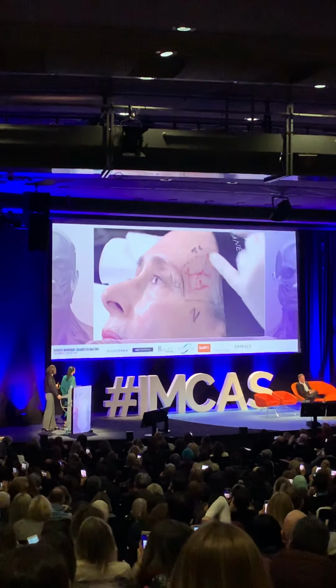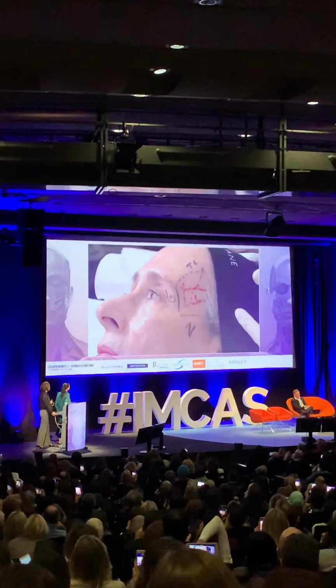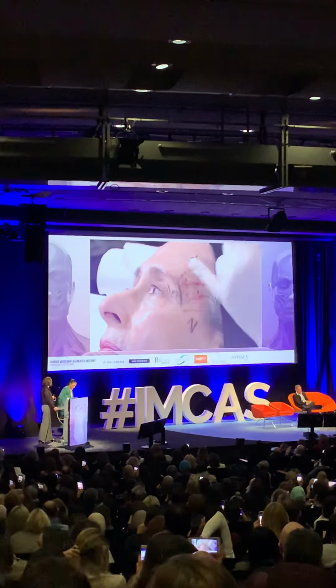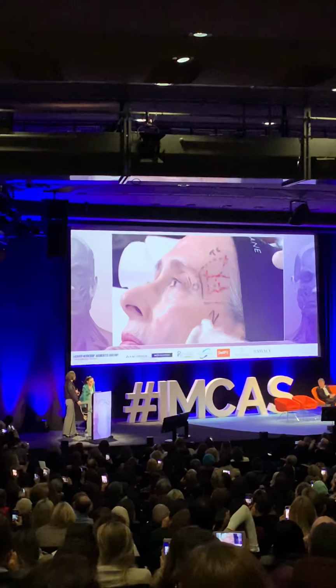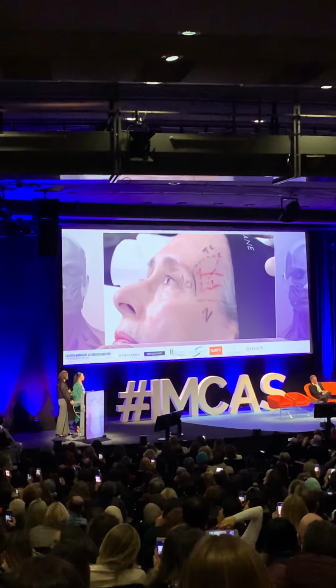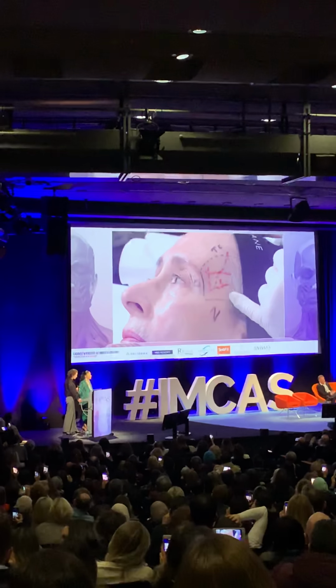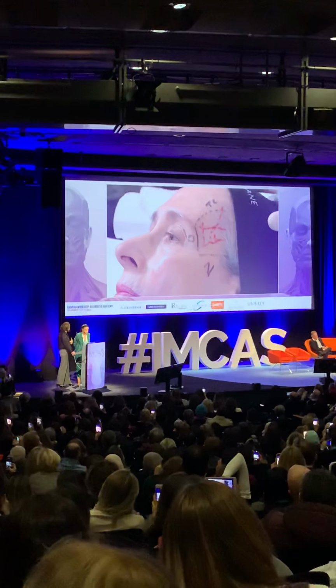So my advice will be to use a product that you can spread and do a nice massage just to have a good shape in this area. Also, if you do something in the superficial area, I always use an anterior point and not in the hairline, just to avoid touching the hair.